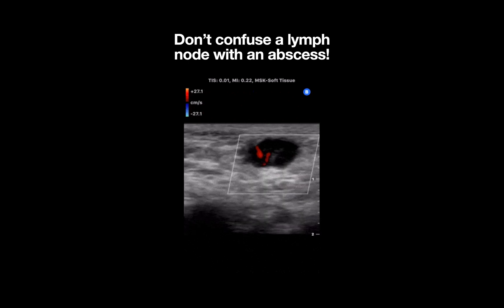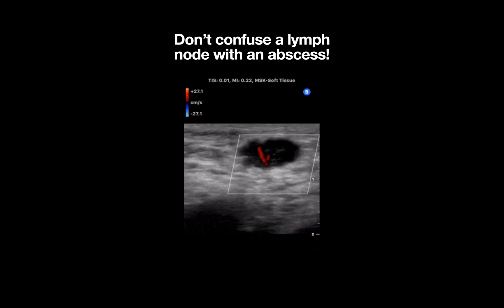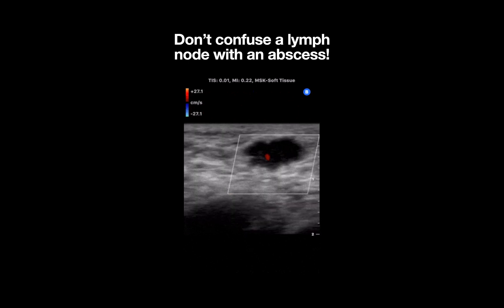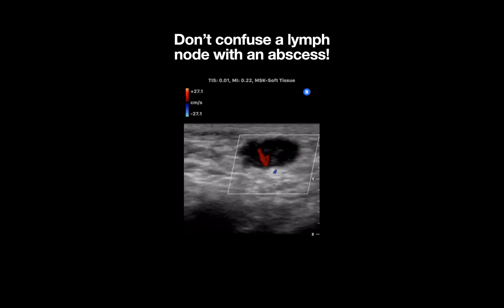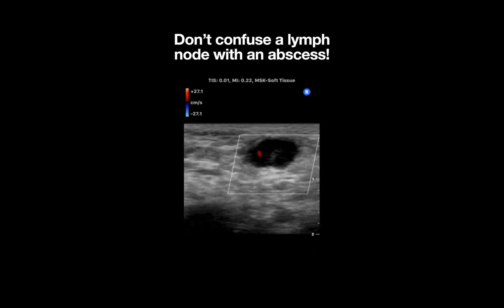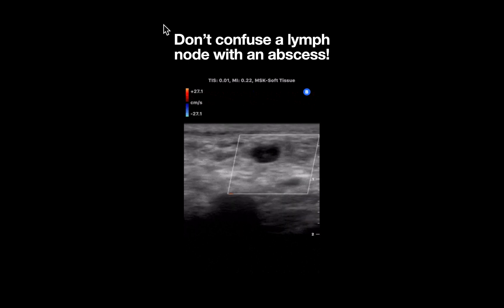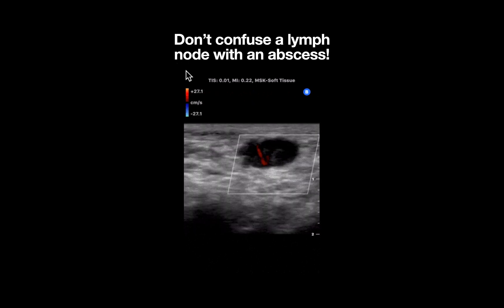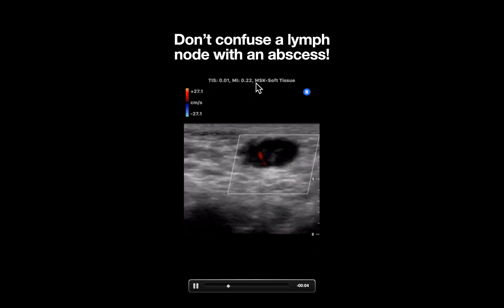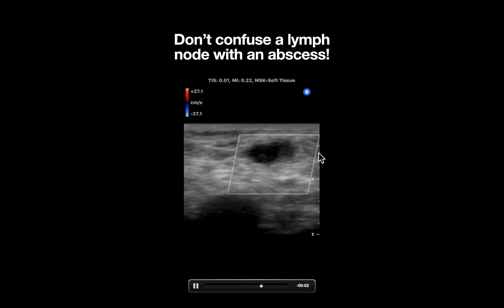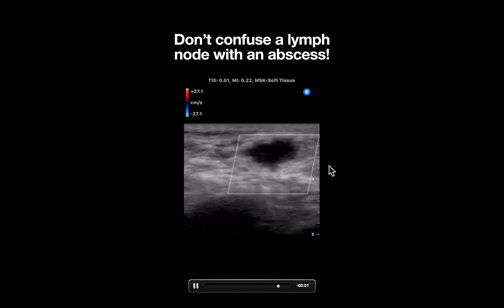This is an ultrasound clip demonstrating a lymph node in a patient presenting with pain and swelling in the groin region. A linear preset is used, as delineated by the shape of the footprint at the top of the screen. Let's break down what we're seeing here.